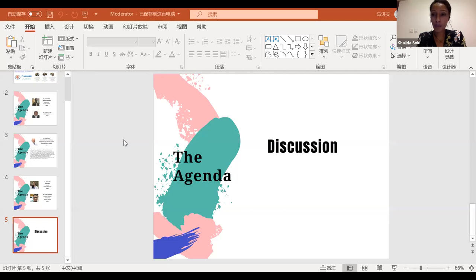I think I'm resonating with all of the things that you are saying. Within the unit, the criticism for CRRT has always been that we don't start it early enough. I've seen that within the unit, we would wait for AKI and try diuretics, and a lot of that within the COVID patients with our CVVHDF. What would happen is that the more I started early, we found the patient stabilizing and giving them that support. And it is in this way with the CVVHDF that we have had two patients surviving, I believe.